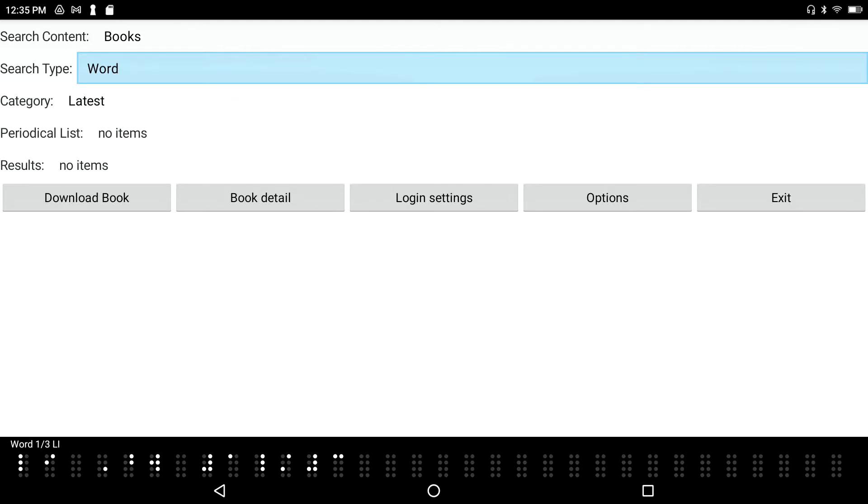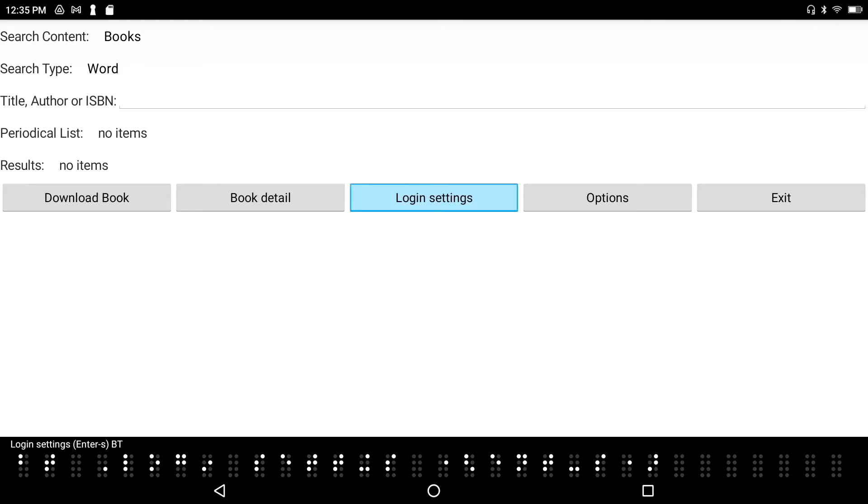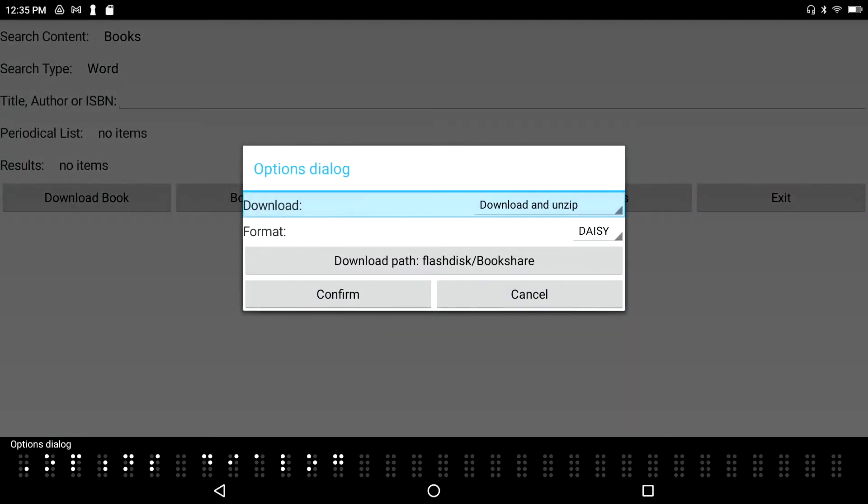Let's tab through here a little bit more. I've got login settings and options. I'll press Enter to go in. Download options: download, download and unzip, download and unzip and open to have the file opened in the HIMS Daisy book reader, or download only.